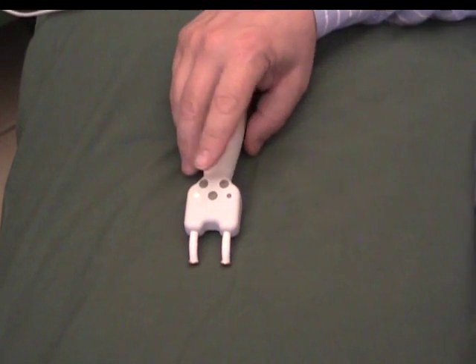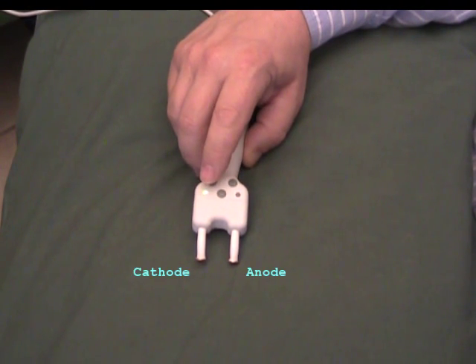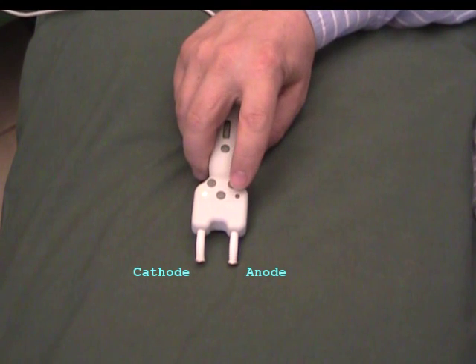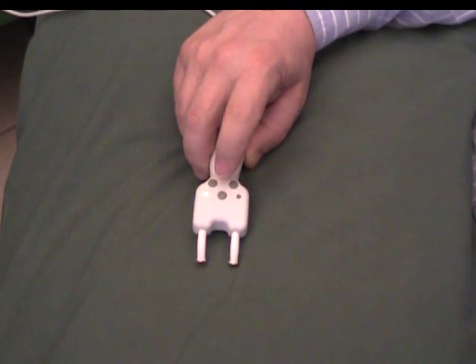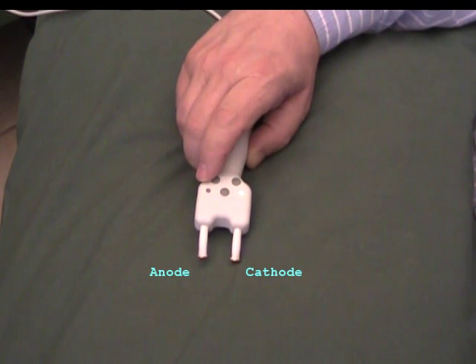Also on the probe, higher closer to the tip, is the indication of the cathode and anode. In this instance the cathode is the lit LED. Anode is the other one. If I press the button I change the cathode to this position and the anode to this one.